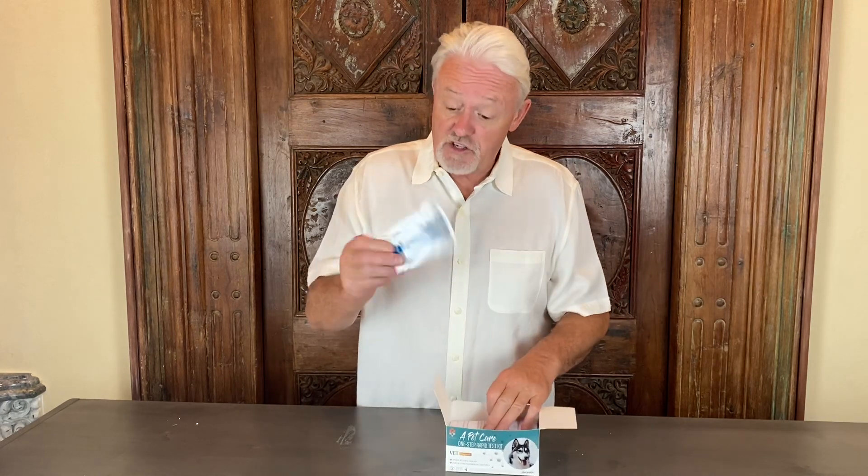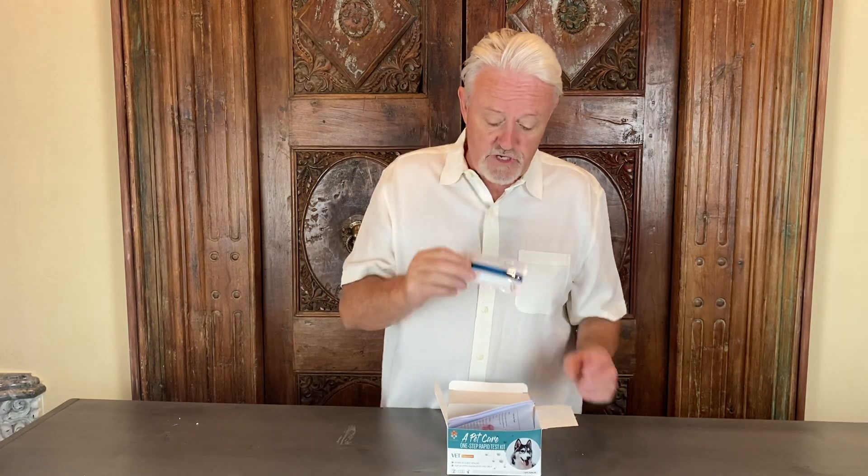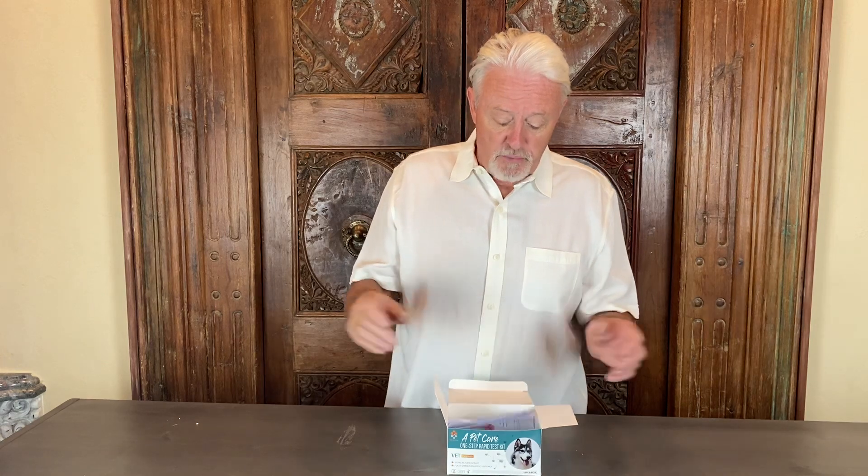I'm not going to open this up because it has a two-year shelf life. You can put this thing away in a cupboard and keep it for two years.